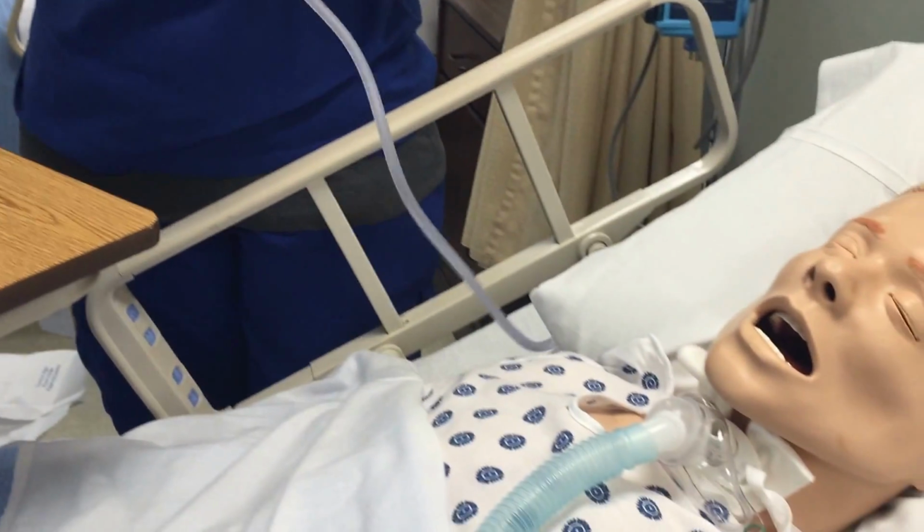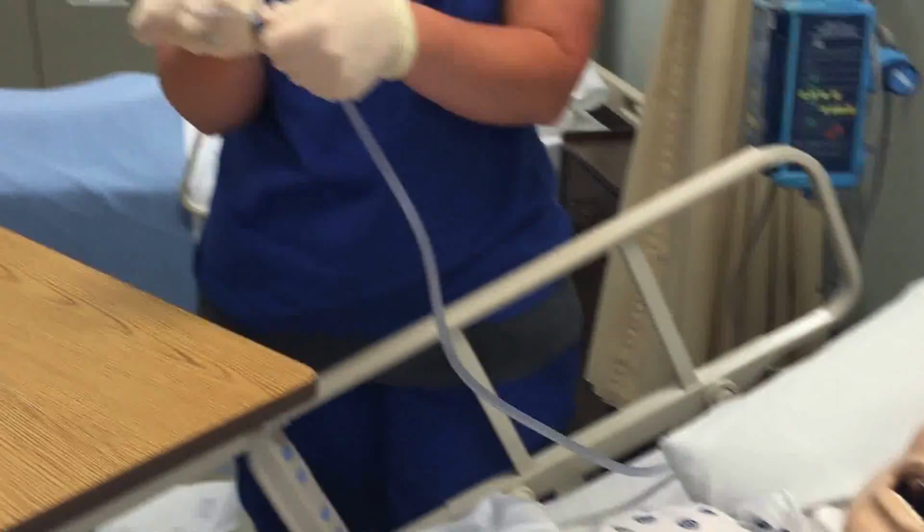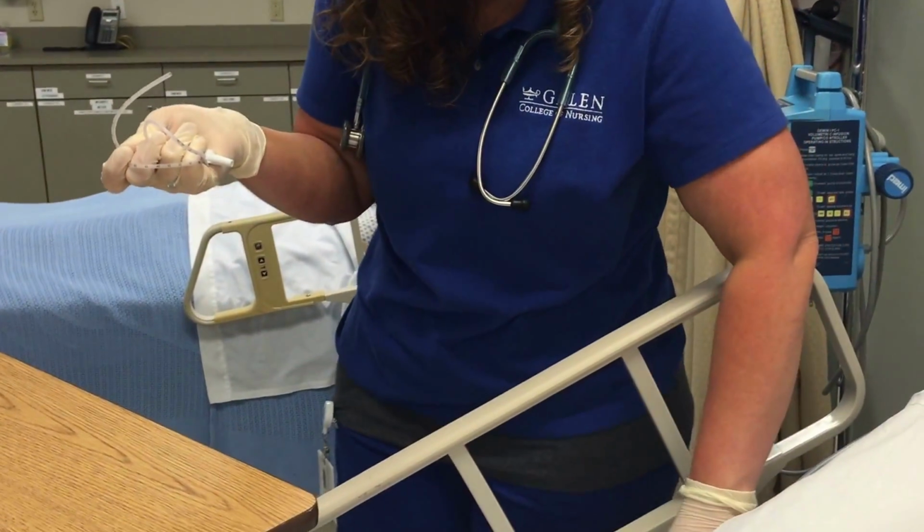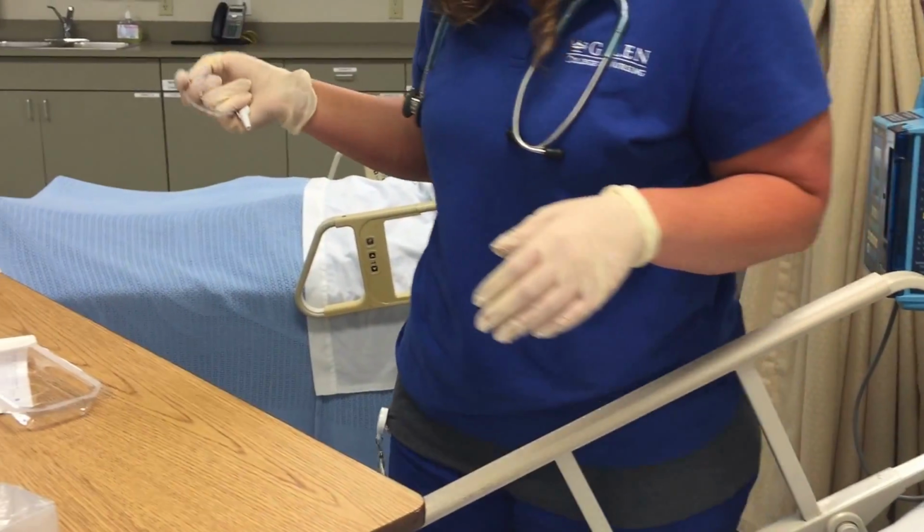If for some reason your catheter does hit anything on the way out, or if it does slip or anything, all you do is just grab a new one, and then just change your gloves, get a new set of sterile gloves. All right.